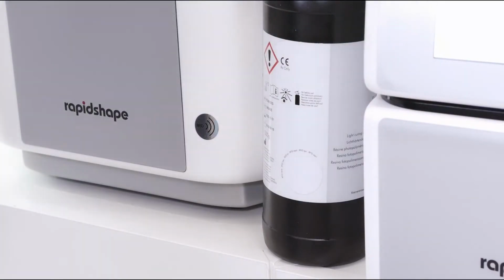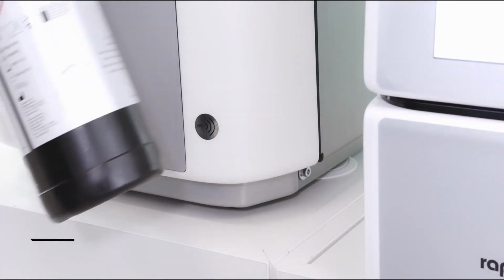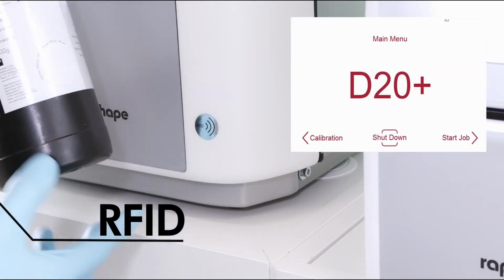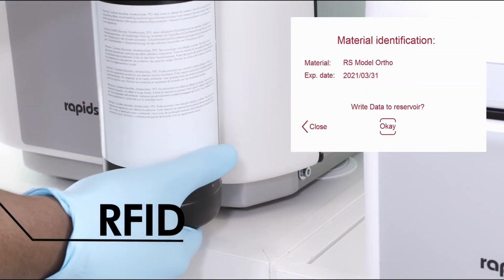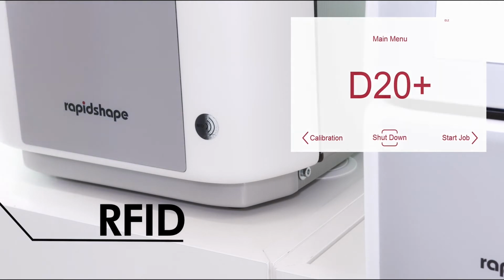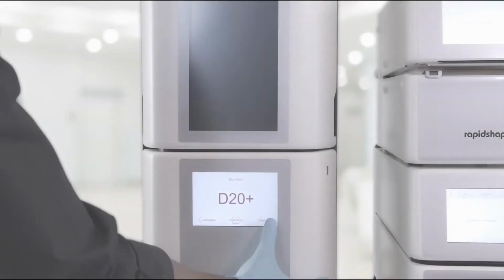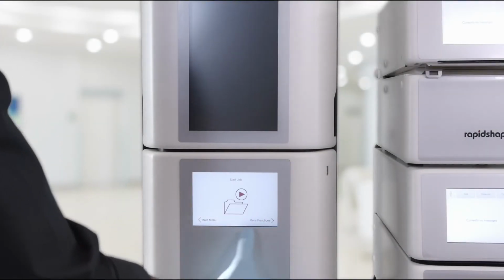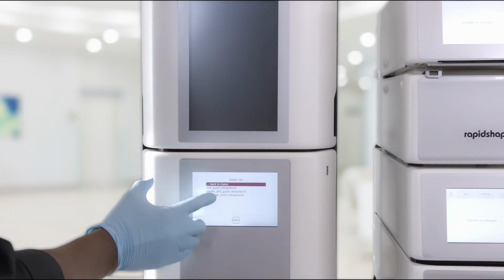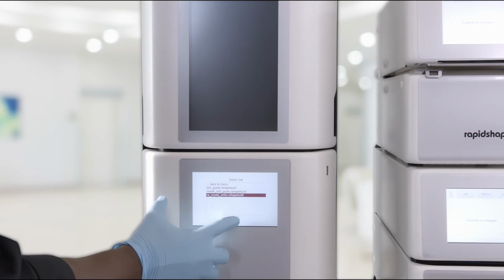To write the material information onto the reservoir, just hold the tag on the RFID tag reader spot. You can now press OK and the data will be written. Now you can head to the Start Job menu, select the job from the list and press Select.